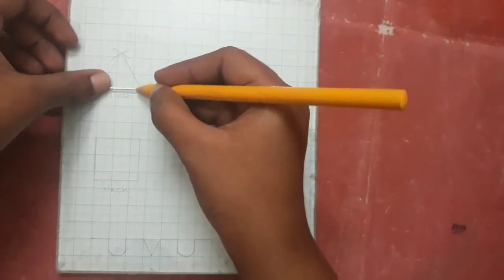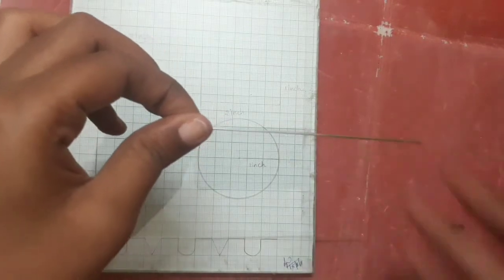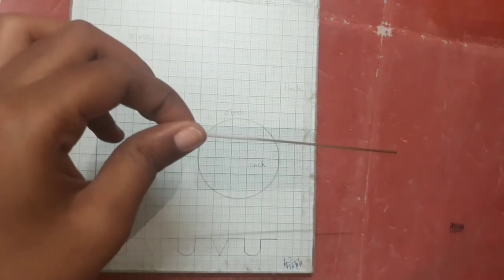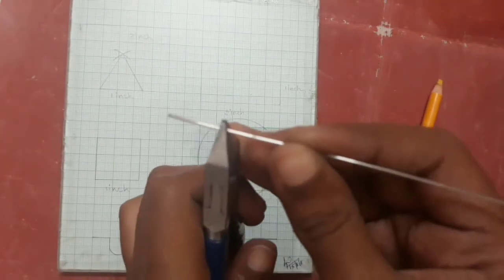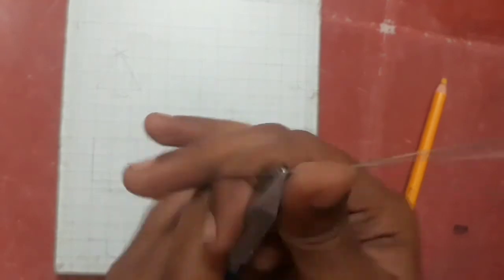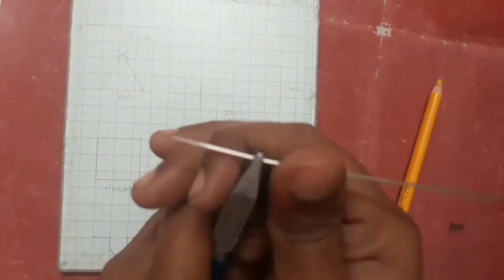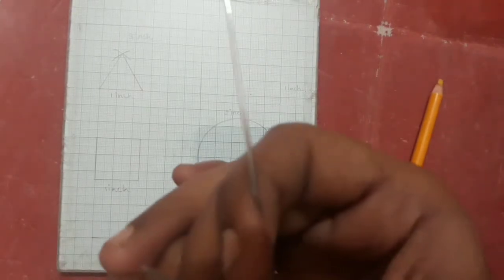First, we will mark the measurements. Make sure to place the Adams pliers at the tip, and make sure to place it on the 19-gauge wire correctly.